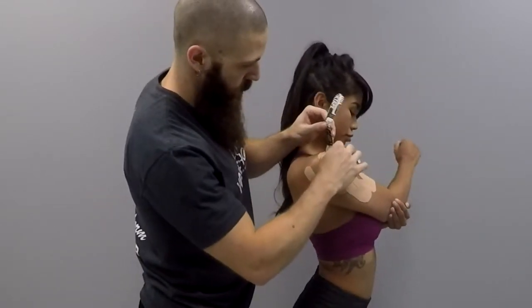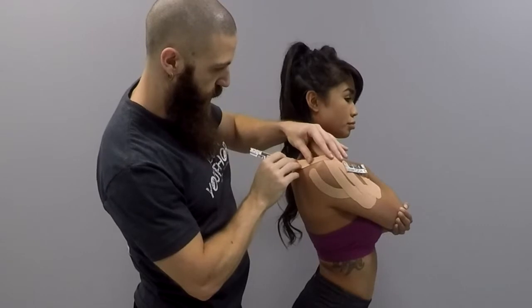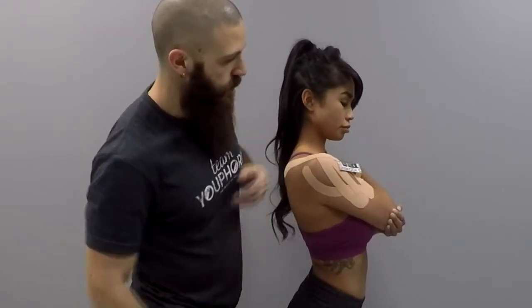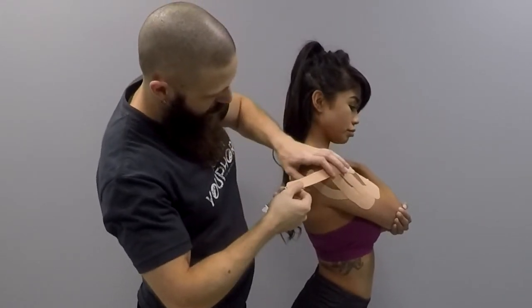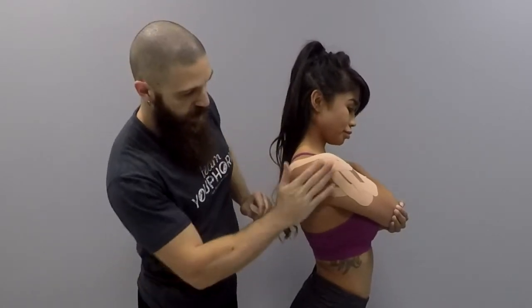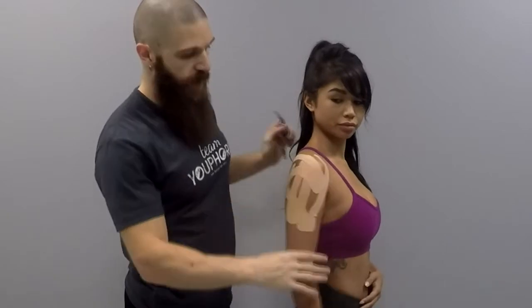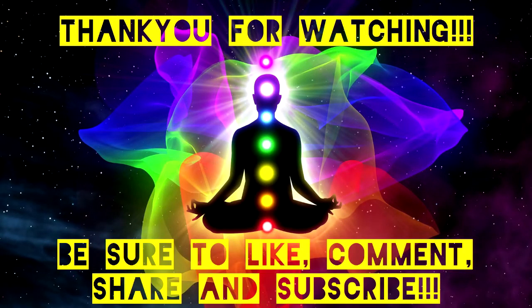With this one, what you want to do is trace the scapula. With very light tension, trace the superior border of the scapula and go to the inferior angle of the scapula. Rub to activate. When they relax, you can see that whenever they move around, you are going to get convolutions. That is going to improve blood flow and help to decrease any pain your client may be experiencing from their adhesive capsulitis. That is all you have to do.